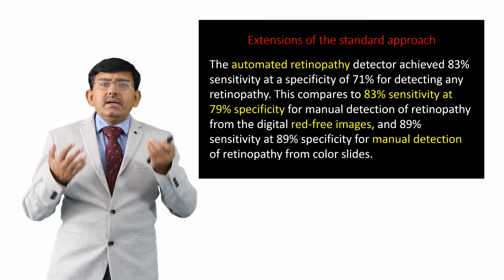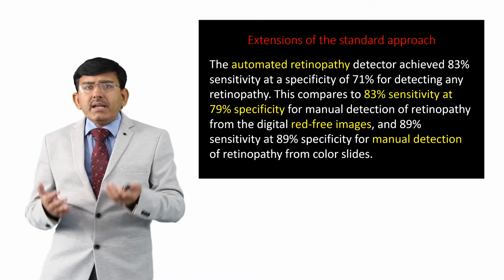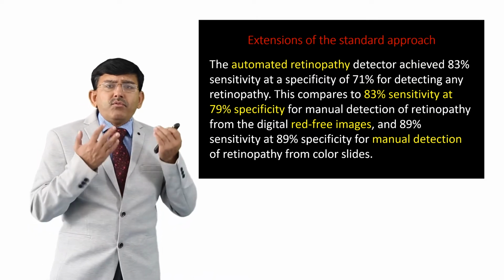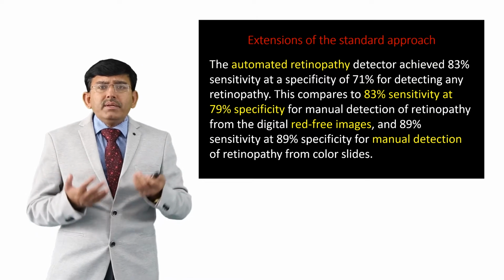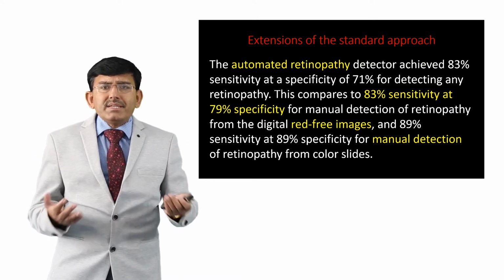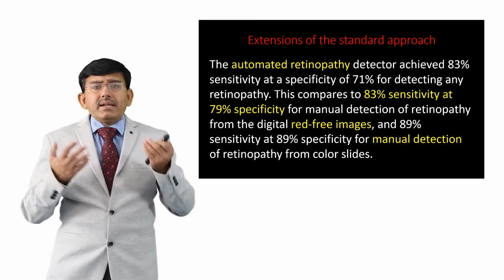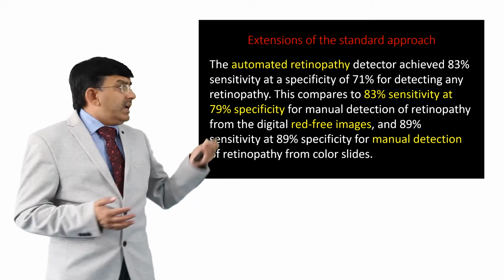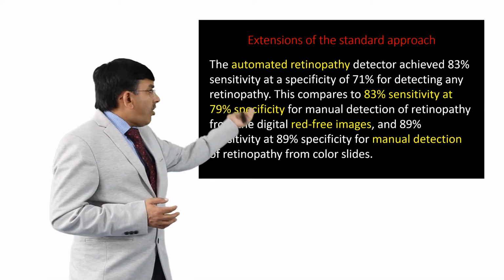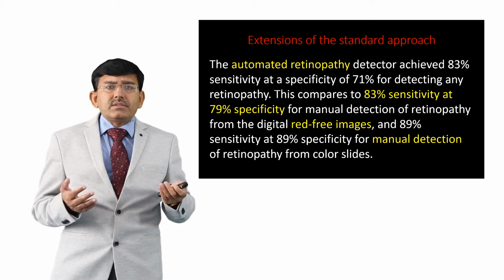This compares to 83% sensitivity at 79% specificity for manual detection of retinopathy from the digital red-free images, and 89% sensitivity at 89% specificity for manual detection of retinopathy from color slides.